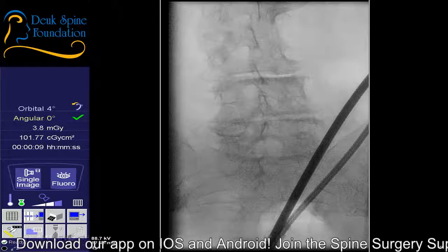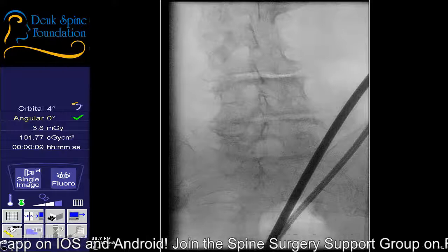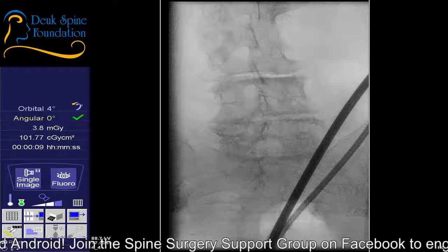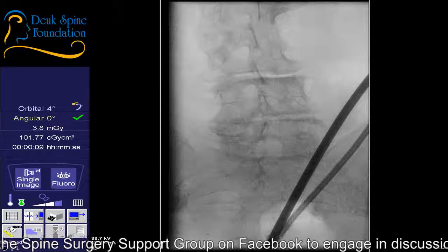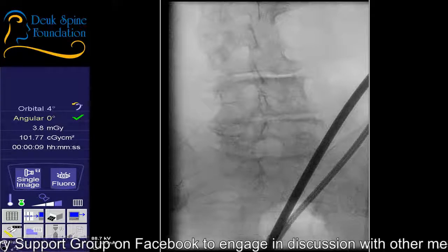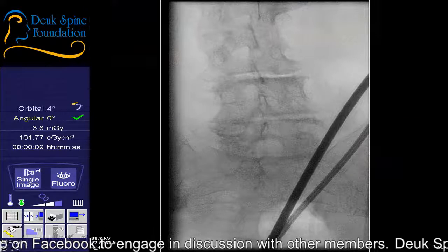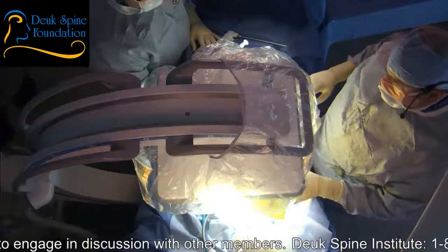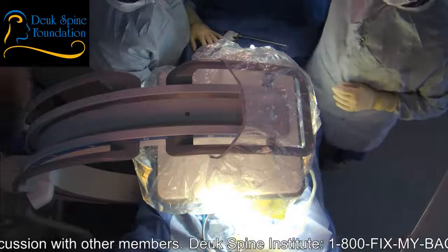And so there's a lot going on structurally, but most of it is not important. The only thing that's important is actually something you can't see, and that is a tear in the back of the disc. You can't see it on x-ray. All right, I'm going to get started. Remember, if you have pain, just let me know by saying ouch, okay? All righty. Shot? Let's go ahead and do a lateral. Let's see where we are.